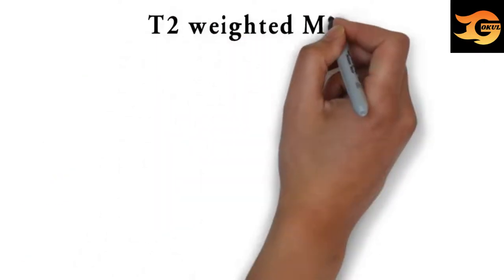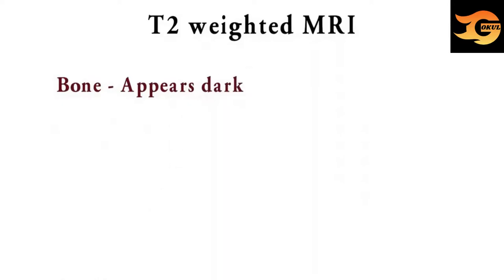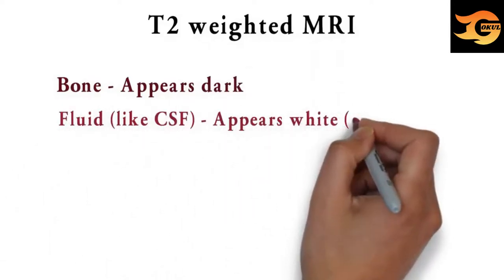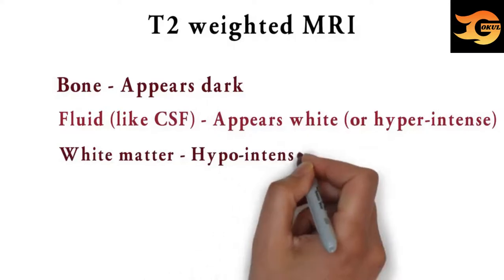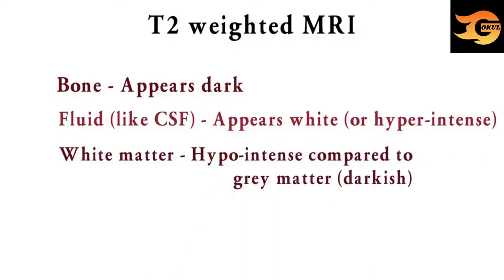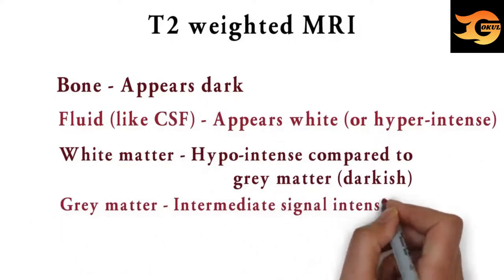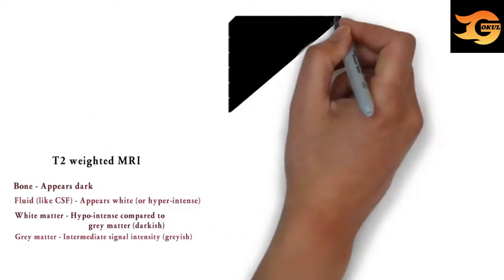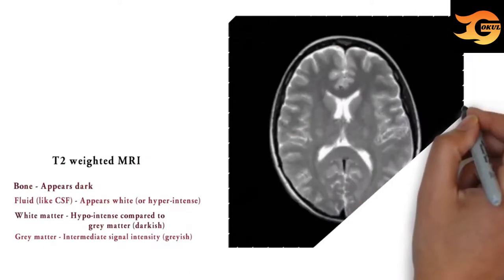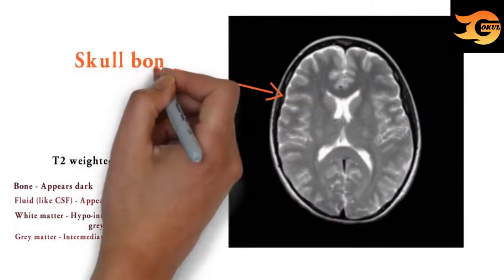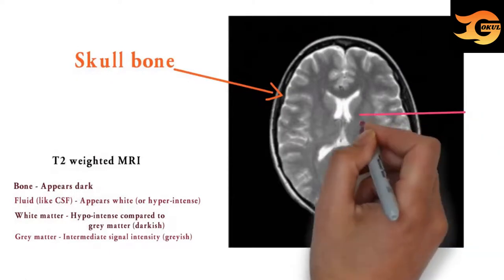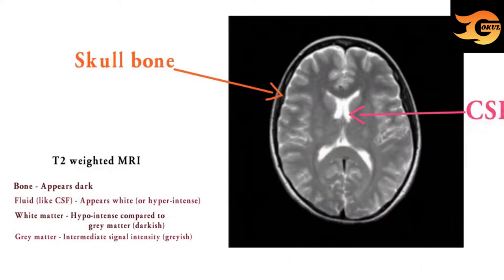Then T2 weighted MRI. In T2 weighted MRI, bone appears dark, fluid like CSF appears white, white matter appears darkish compared to grey matter, and grey matter appears grayish. This is T2 weighted MRI in which skull bone is appearing dark, CSF is appearing white, and white matter is appearing darkish compared to grey matter.